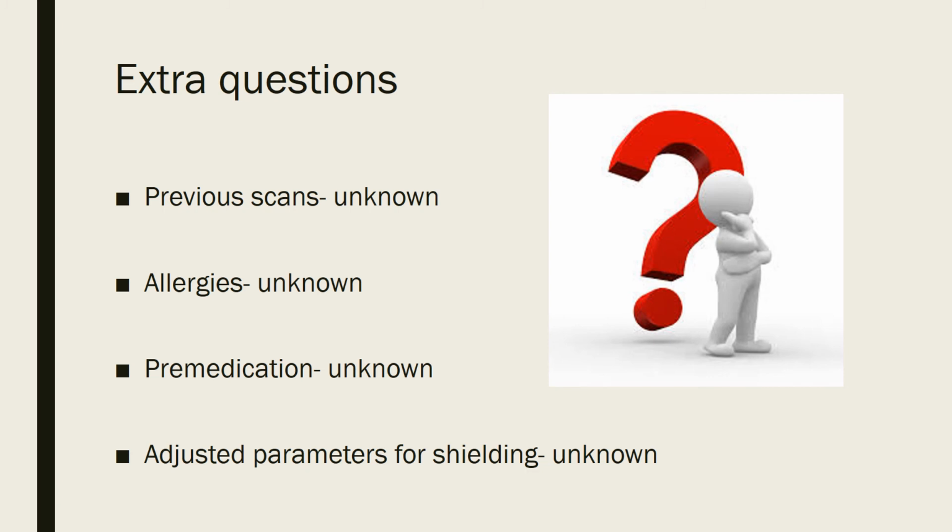No pre-medications were noted either. And it's unknown if they adjusted any parameters for shielding to save the patient dose, although I don't really know how likely that would be to be done on a patient around her age.